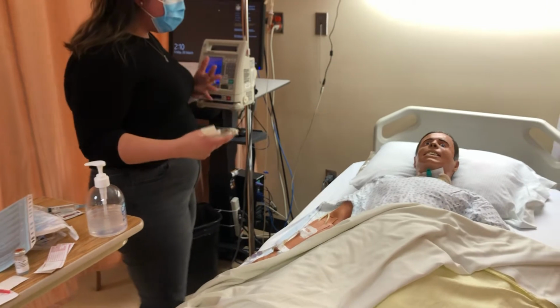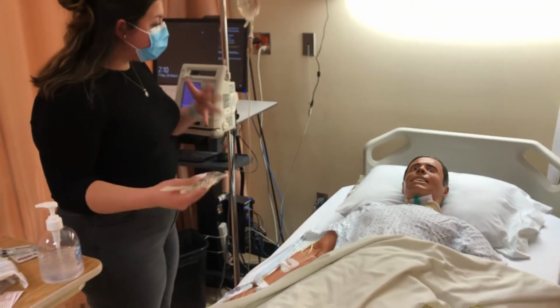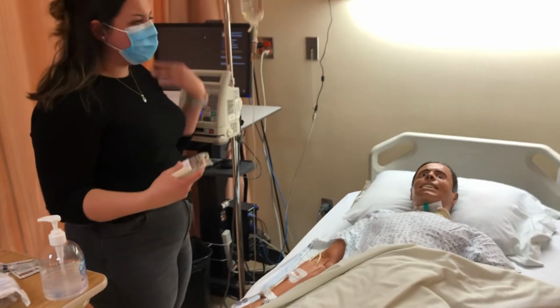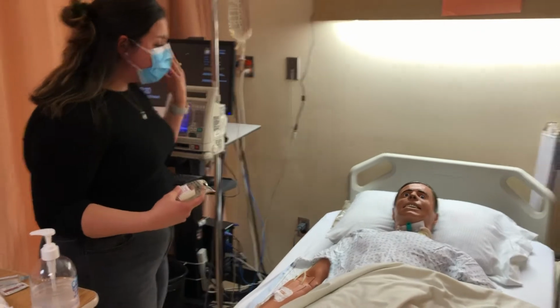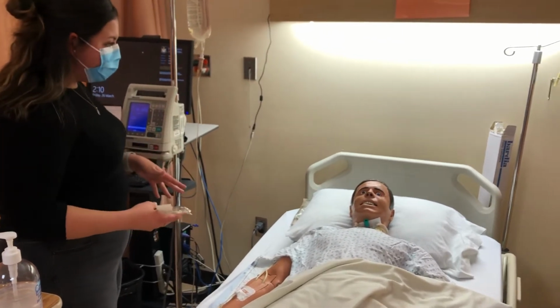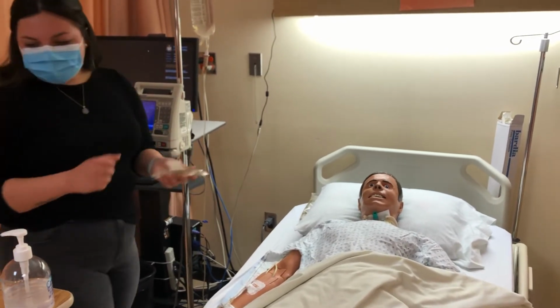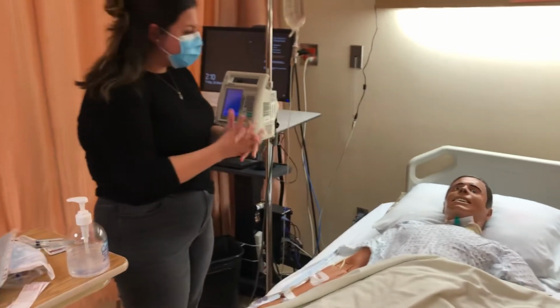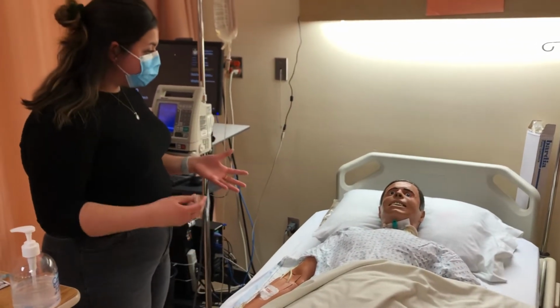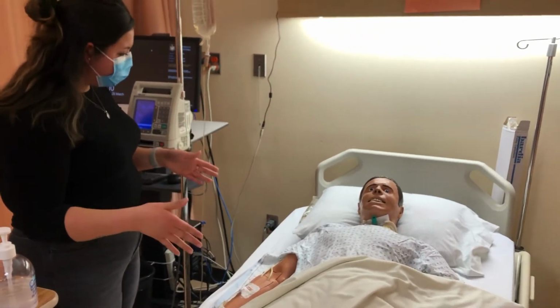With insulin, you might experience some side effects like hypoglycemia or low blood sugar. So if you start to feel sweaty at all, if you start to feel any heart palpitations, hungry, or have blurred vision, please let me know and I will come assess you immediately. It's really important that you let me know. Are you okay with receiving this drug? Excellent. And throughout this continuous infusion, I will be assessing your blood glucose and your vital signs often to ensure that we can get them within the correct range that the doctor has ordered.